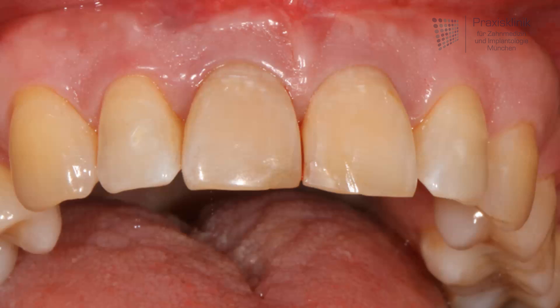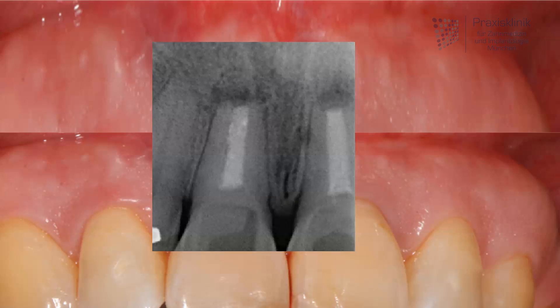You can see here the initial situation of a patient showing us the two central incisors in the upper jaw. If we are suspicious, we can see the teeth have a little bit darker color than the residual dentition, and because of that we take an x-ray, where we can confirm our suspicion and see two root canal treatments in those teeth.